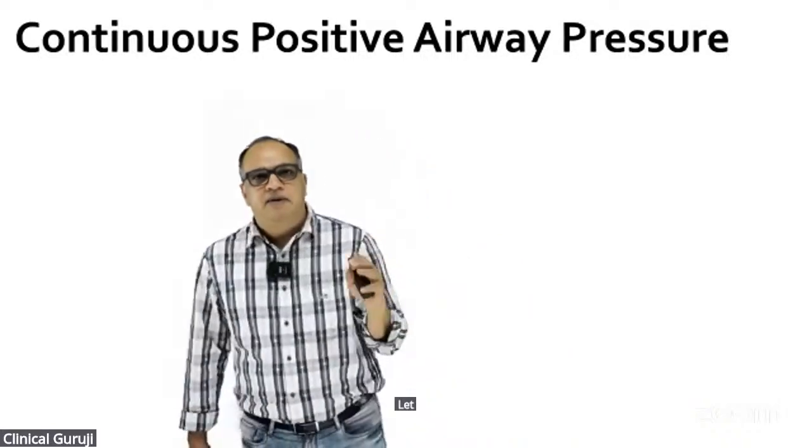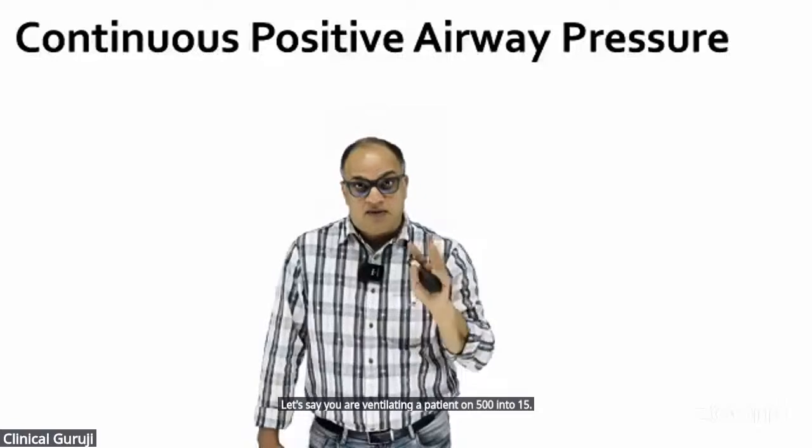Let's say you are ventilating a patient on 500 into 15 ACMV.